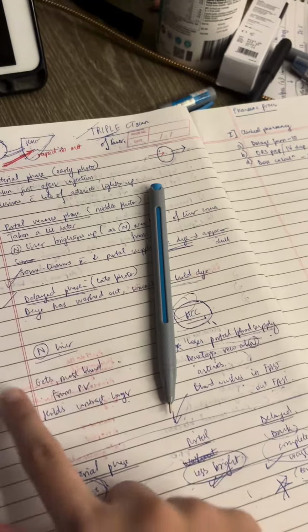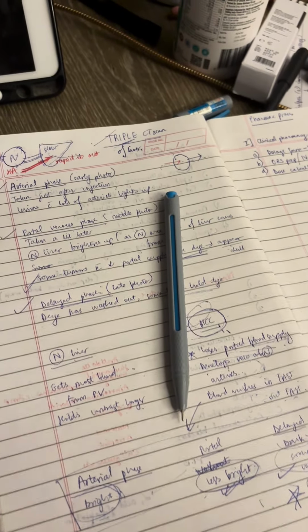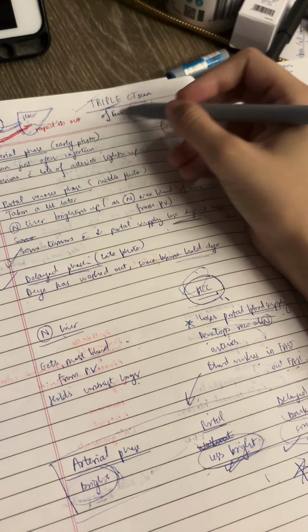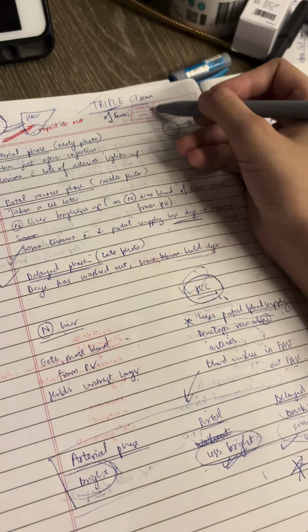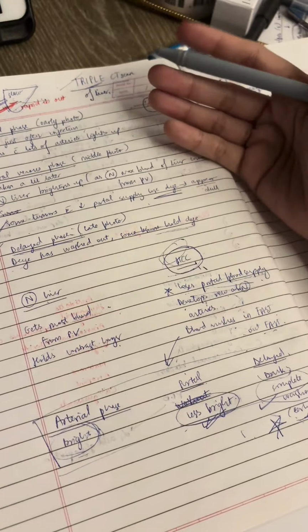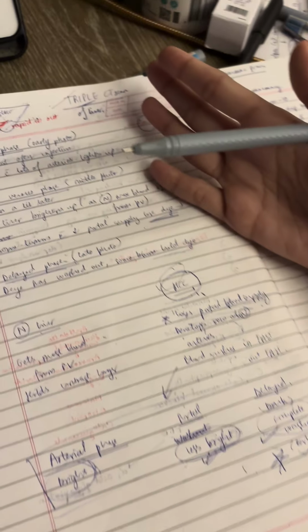I'll also include a table which has all the lesions and their findings on a triple CT scan of a liver, and then you can intuitively understand the blood supply and the nature of the blood supply of each of these lesions. So you won't have to rote learn any of the findings once you know the character of the lesion.